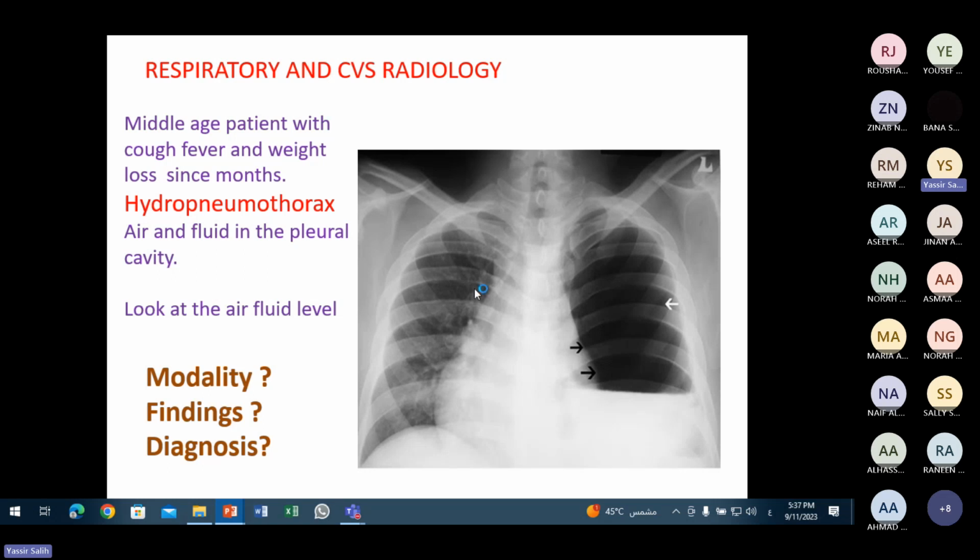What is this exam? Doctor, this is a plain X-ray. Yes, plain X-ray of what? Skull. The chest. Yes, this is a plain X-ray of the chest. All right, describe the abnormality. Hyperlucent on the left side.